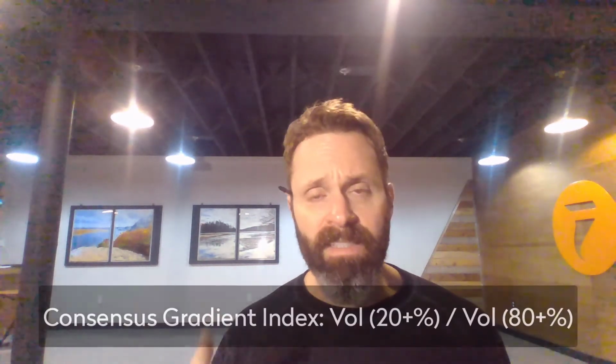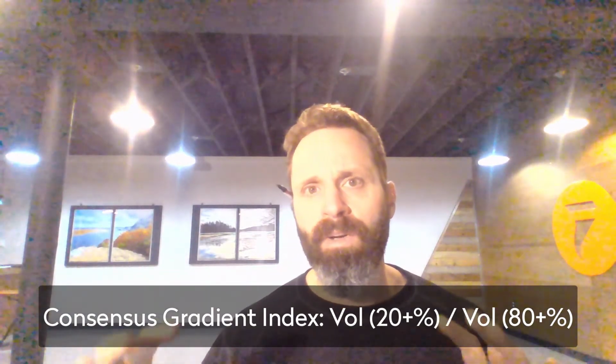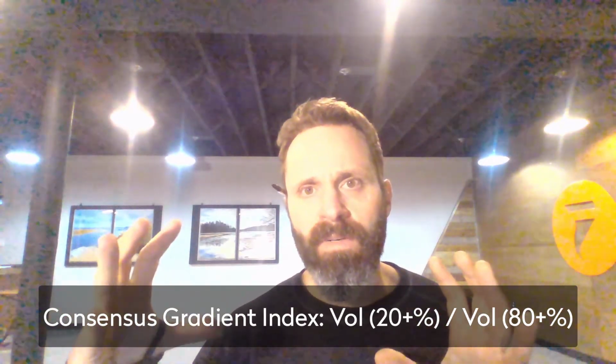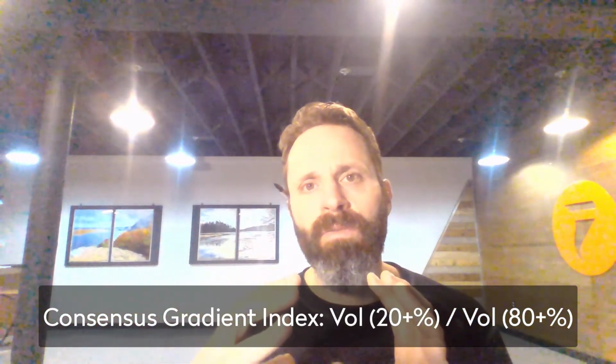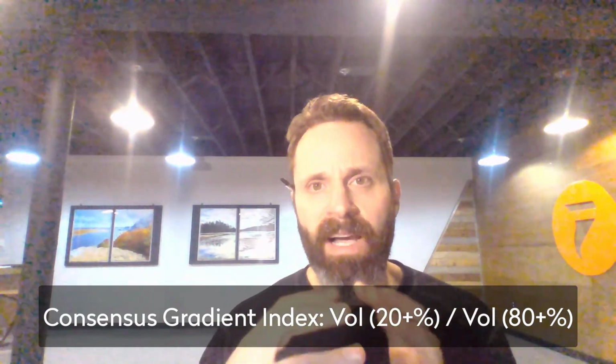Second, we're going to look at the consensus gradient index. So I think we're going to go with the ratio of the volume where 20% of the people thought it was, so a larger agreement cloud, divided by the volume of what 80% of people thought it was. So that's higher consensus. So again, as I explained in a prior video, I kind of go through the methods of how we study consensus. The closer that number is to 1, the less variable it is, and the higher it is, the more variable it is, just like a dose gradient index.